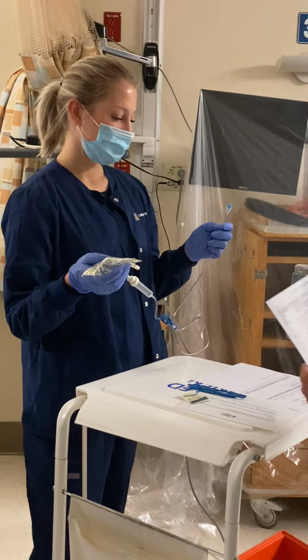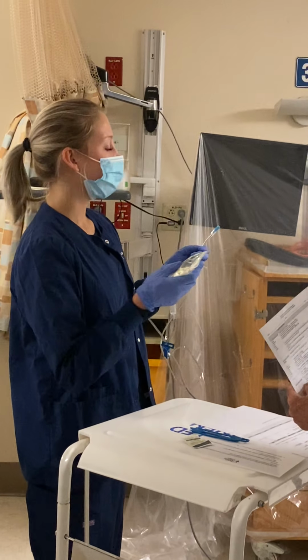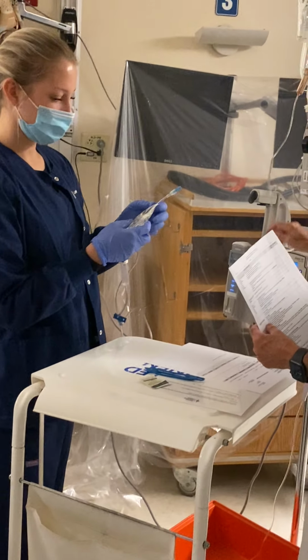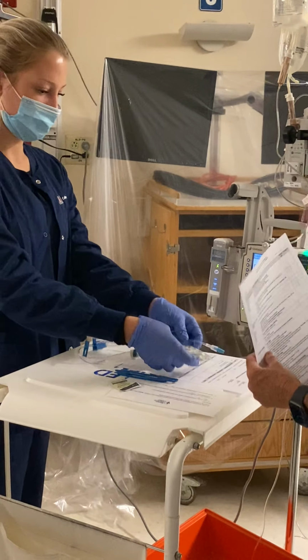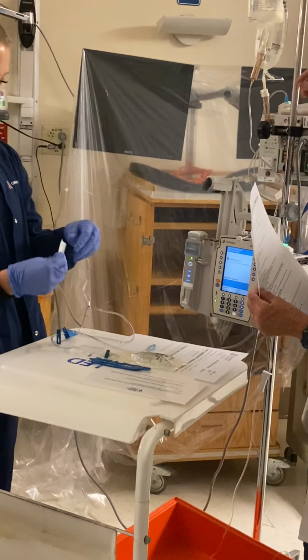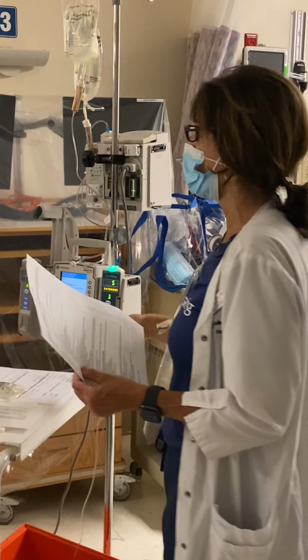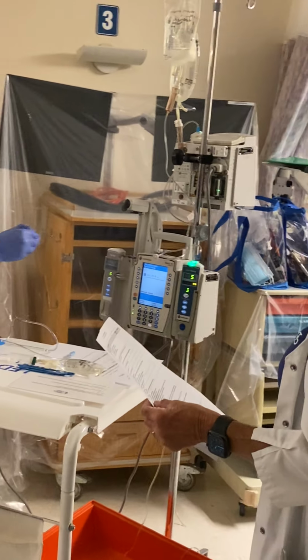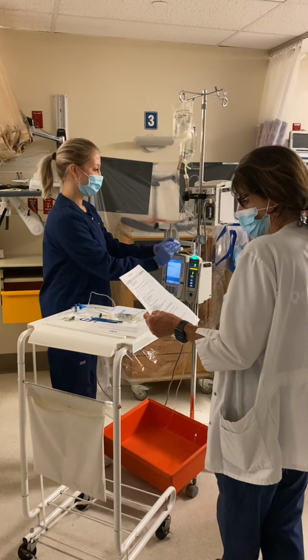Okay, and so now you're going to have to scrub the hub, so you can set that down. Some people hang it up, and then when you back prime, you lower it. It's up to you. But in the meantime, it can sit on the table.